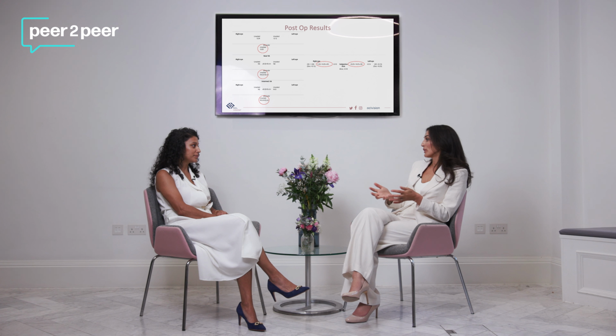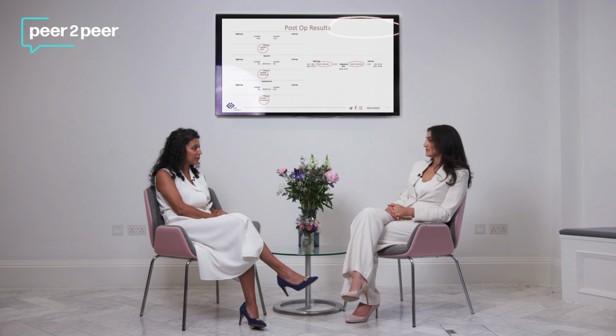I think it goes to show as well in patients who've had LASIK before, who have those natural aberrations in their cornea, they're able to get a nice range of vision. You know, we targeted -1.5, but we got N4, which is brilliant. And it just goes to show you don't necessarily need to use advanced optic lenses for these patients to have really good outcomes. I think, Masara, you look quite closely at the Pentacams, don't you, on this patient, just to have a look at the aberrations on the cornea to see if they're going to have depth of focus and what kind of near vision they will end up with. You can see here how that's paid off just by looking really closely at those scans. Yeah, definitely.